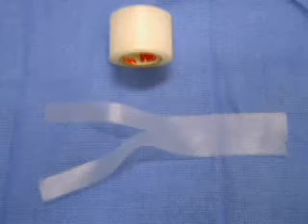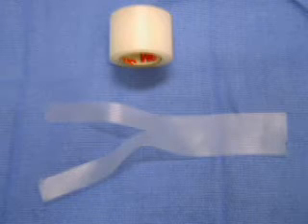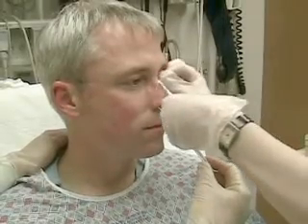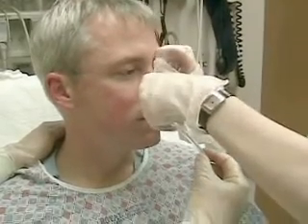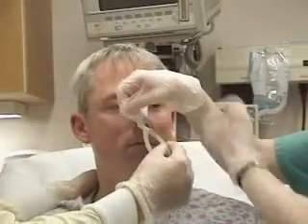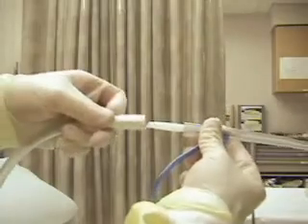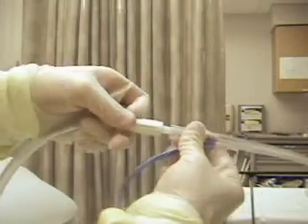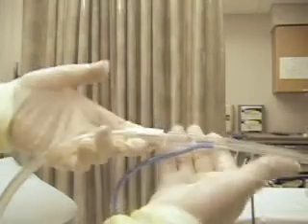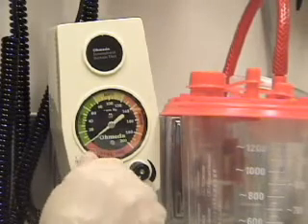Take a 5 to 7 cm strip of adhesive tape and tear it vertically for one half of its length. The wide section is placed across the patient's nose and the two tails are then wrapped in opposite directions around the NG tube. You may now connect the nasogastric tube to suction. Turn on the suction and adjust the vacuum force as desired.